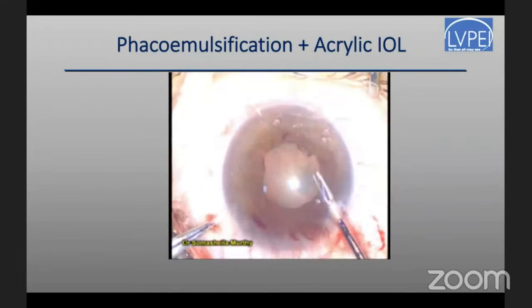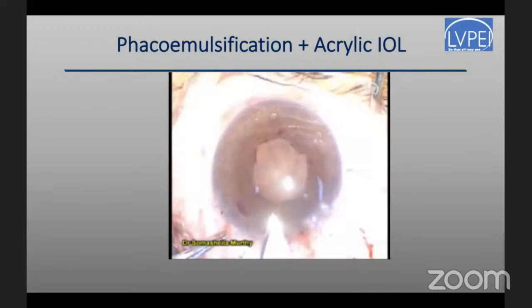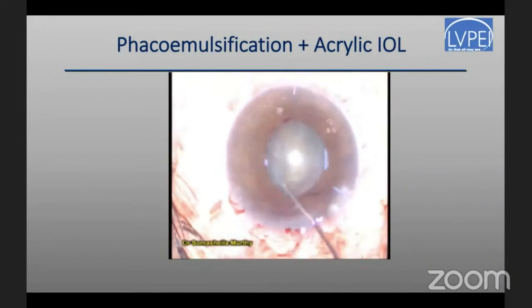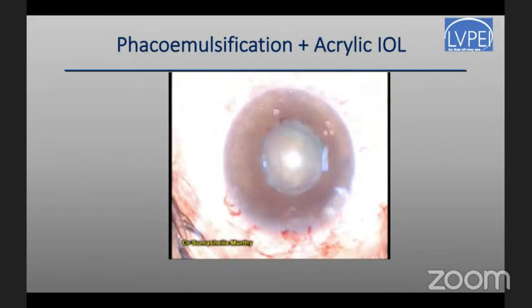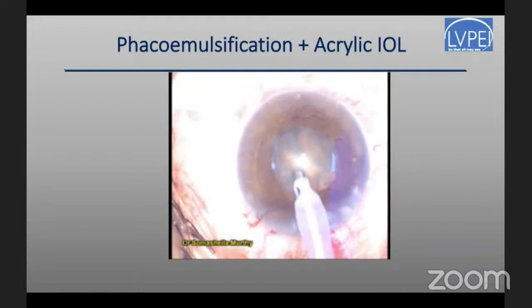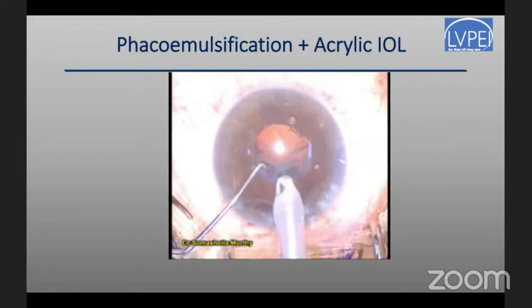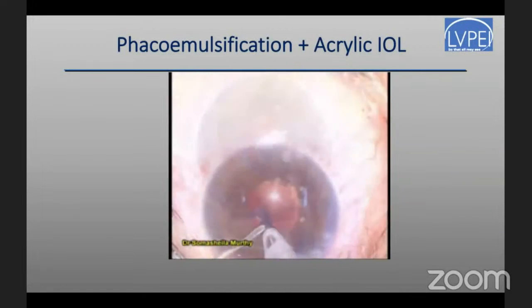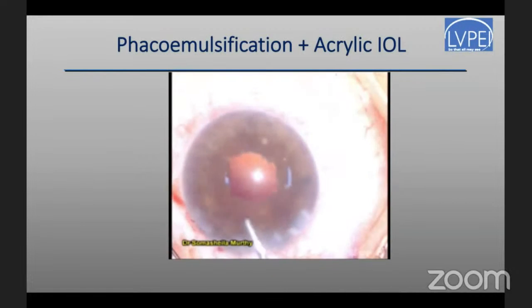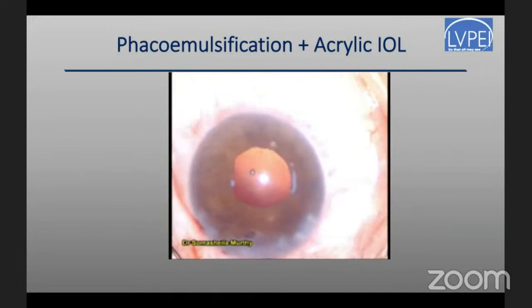After that, most of the time, this amount of pupil size is adequate for us to safely perform cataract surgery, especially since the cataract is usually very soft in these young patients. After hydrodissection, you can notice that the nucleus is maybe grade 1 to 2. By simple phaco aspiration, or with minimal energy, the entire nucleus can be removed in toto. The next part involves a very thorough cortical cleanup to ensure that we do not leave any of the inflammatory cortex behind.